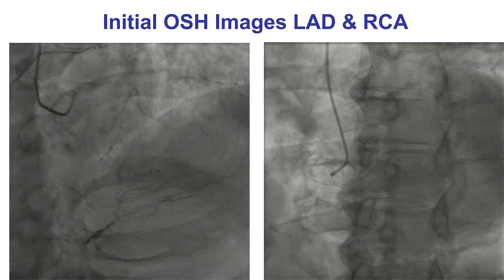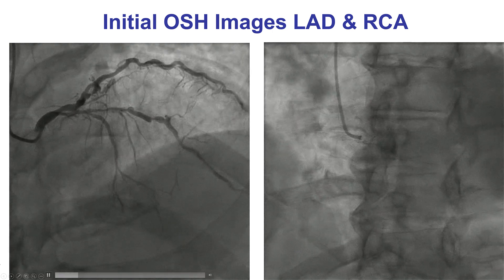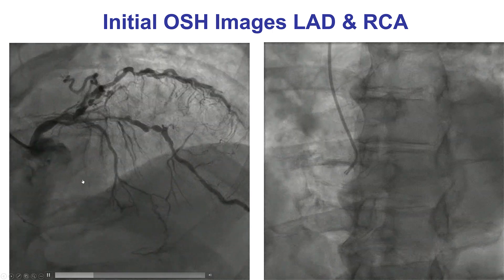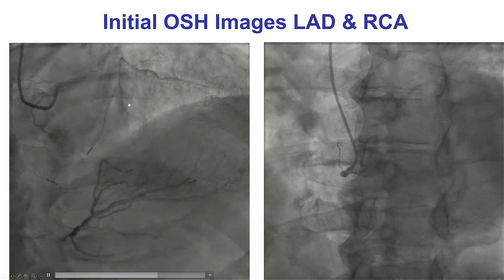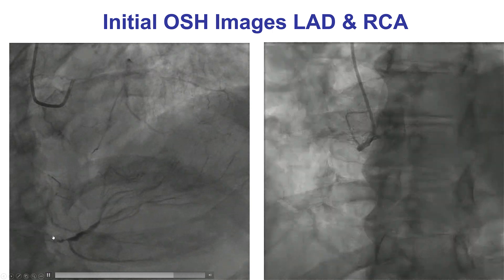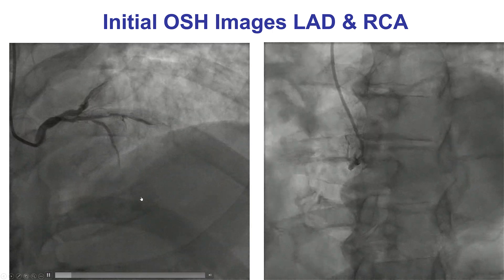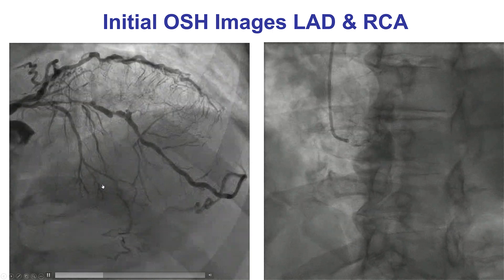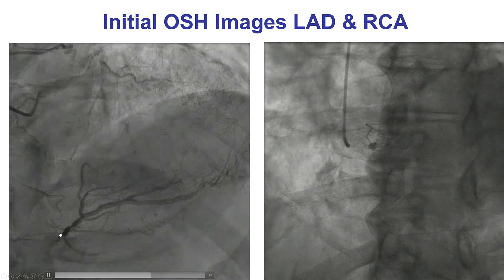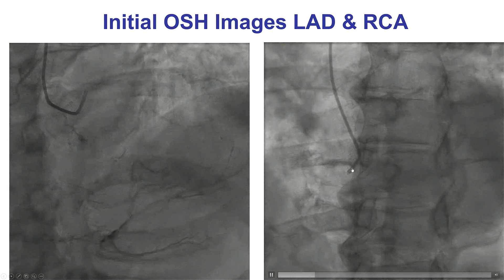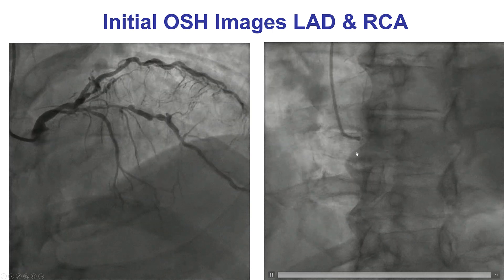These are the diagnostic images. The patient had severe calcification and severe disease in the left anterior descending artery. There is a CTO of the right coronary artery with a distal vessel filling via septal and also via epicardial collaterals. The right coronary artery was occluded in the ostial segment.